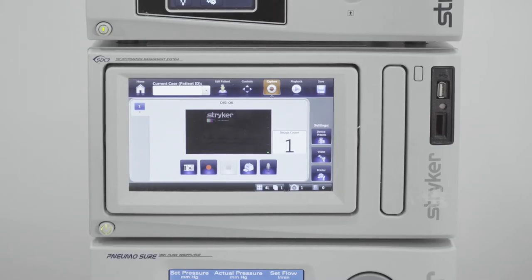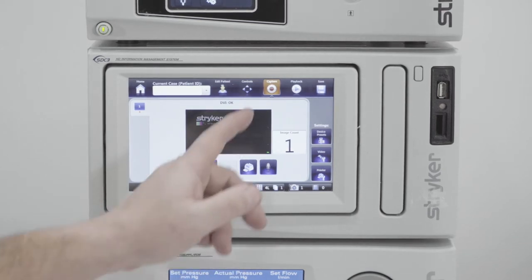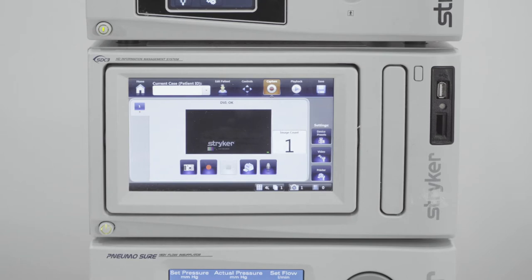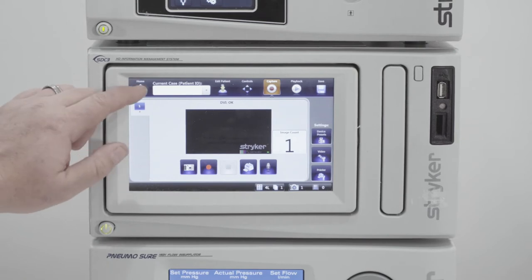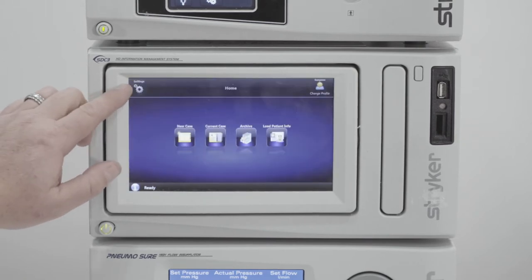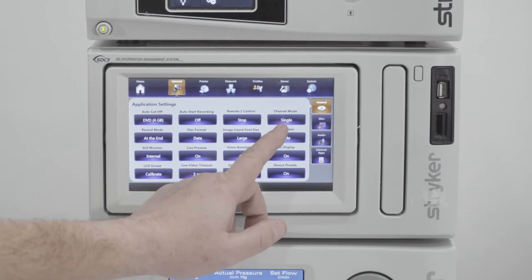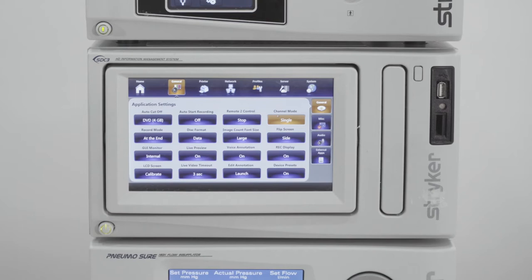From the main screen of the SDC we're currently in the capture screen. We want to focus on the dual channel mode and how you get to it. You go to Home, then Settings, and look for Channel Mode — right now it's set on Single. We want to switch that and move it to Dual.